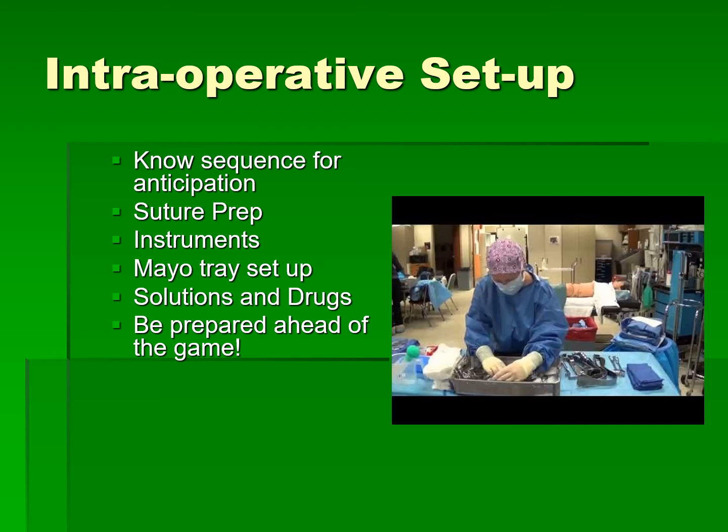We want to think about what instruments we're going to put up on the Mayo stand, how we need to prepare the medications. Do they need to go into a syringe? Are they going to be loaded into an asepto? Those kinds of things. We want to be taking this time to get in the game, all right? And get our head in the right place. Think about the steps 1, 2, 3, 4 that we can anticipate, all right, for the surgical procedure.